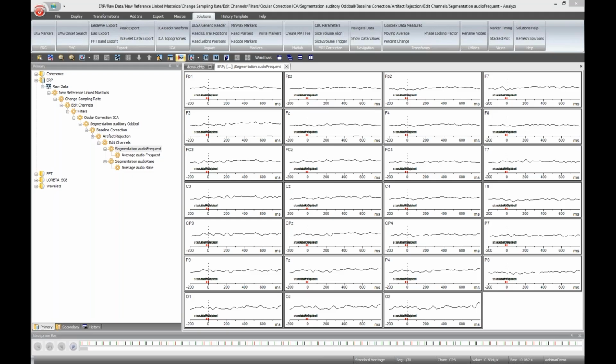There's another interesting question. How many channels are needed for coherence analysis? Are 32 channels enough? If you're doing coherence analysis in the electrode space, based on the electrode signals, the number of electrodes actually doesn't matter in itself, because what you do is calculate coherence between two signals, or 3 or 4 or 5. So there's no minimum number of channels you need. The minimum might arise from some other processing or pre-processing steps you used before.